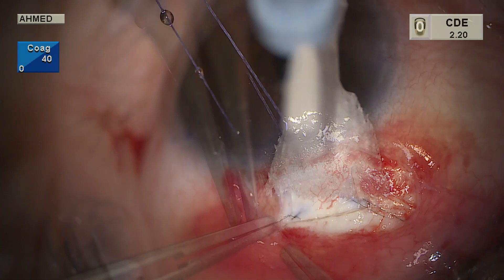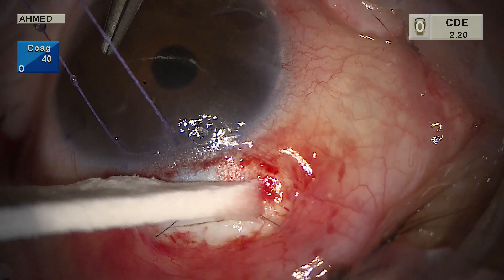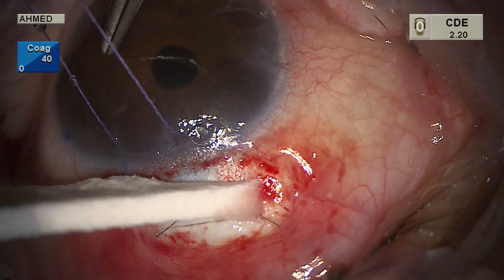Aqueous can be seen oozing around the flap while the anterior chamber remains well maintained. It's important to identify this to ensure the AC will stay formed postoperatively and prevent shallow chambers and hypotony. Sometimes additional sutures are required.